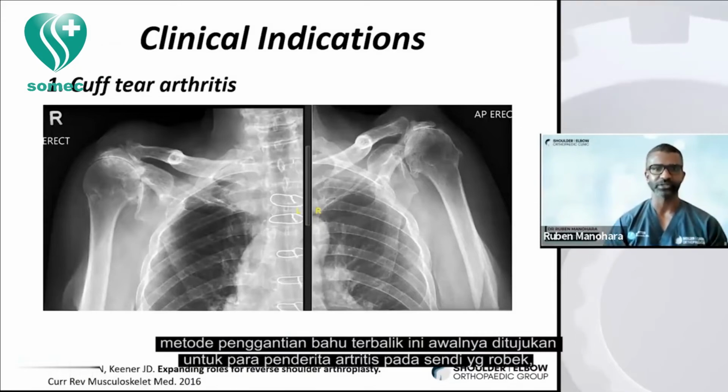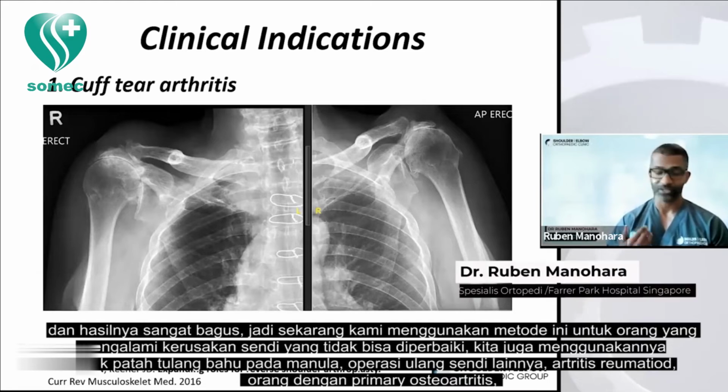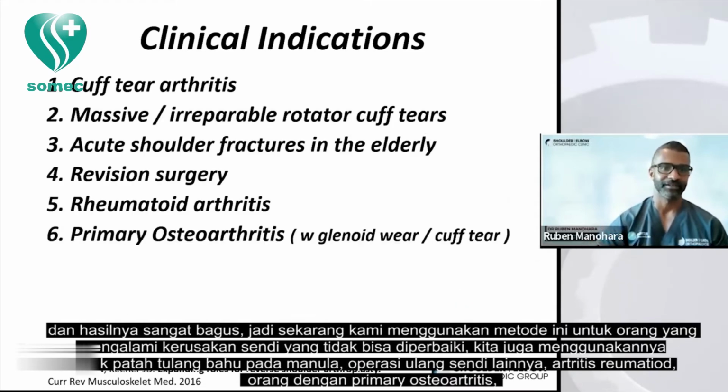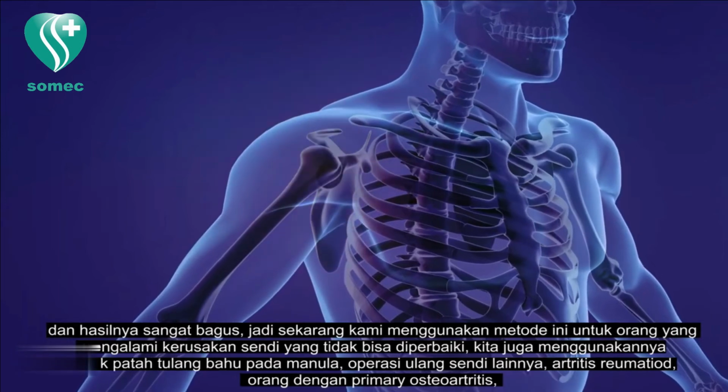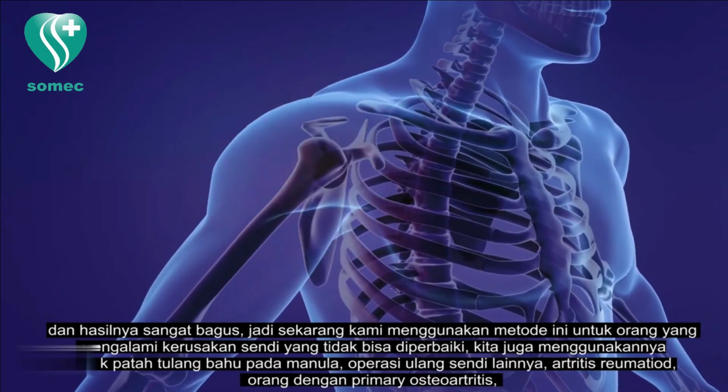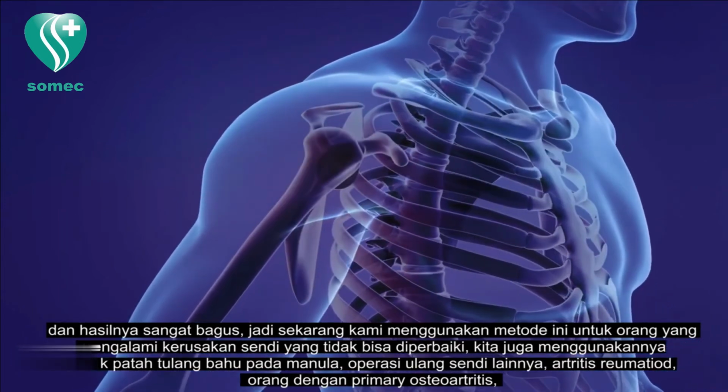This reverse shoulder was first created for people with arthritis and rotator cuff tear. But the results were so good that the indications just exploded. So now we do this RSA procedure for people with massive or irreparable rotator cuff tears. We use it for acute shoulder fractures in elderly patients. We use it for any kind of revision surgery.